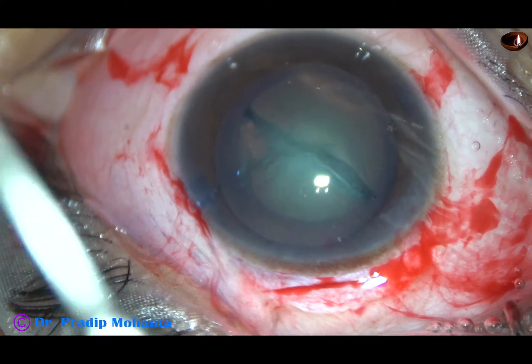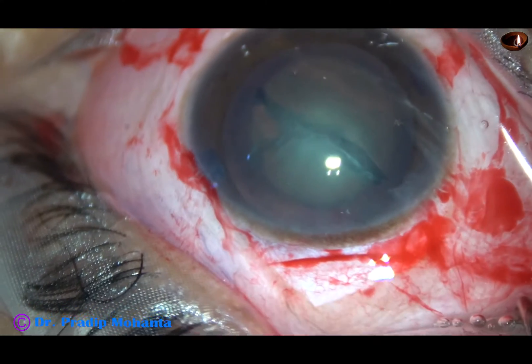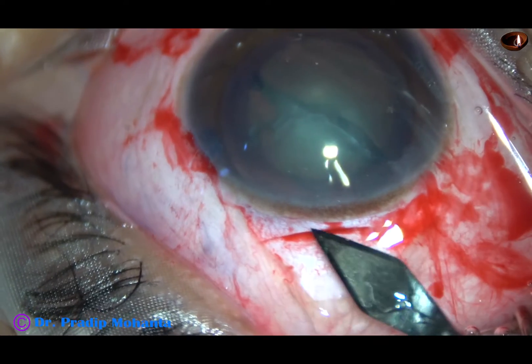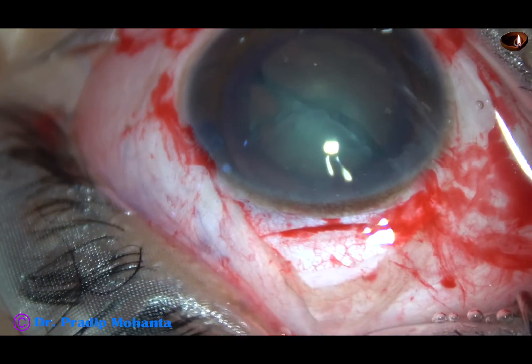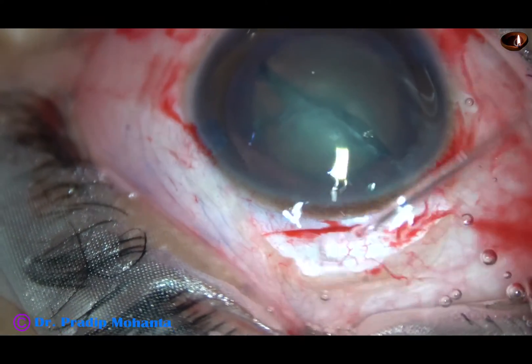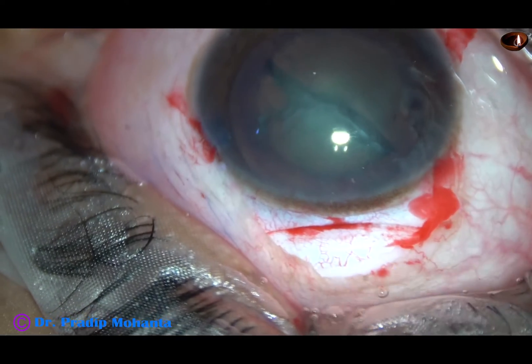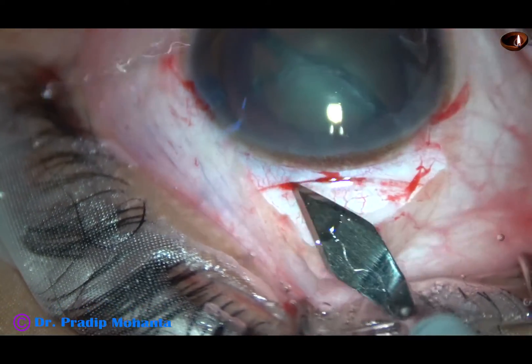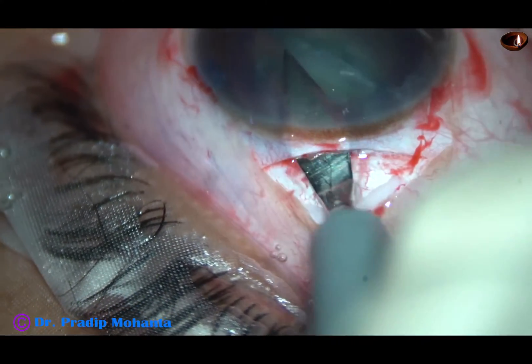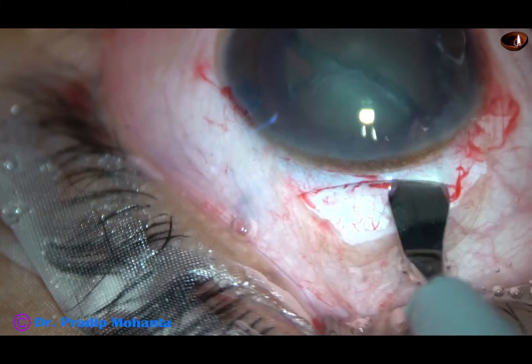Now I come out, inject some more visco, and now I am going to open the tunnel. I take a keratome, go to the anterior extreme of the sclerocorneal tunnel, and then go downward. Now I open the tunnel and cut the tissue as I go forward.